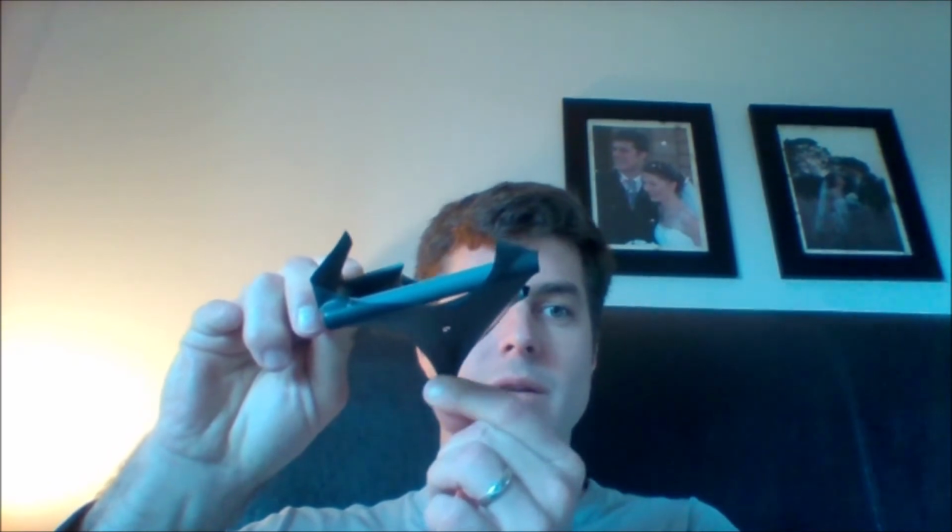It's not going to go in and work perfectly the first time, like with your first couple of rubber dams. I'm sure might have been a mess. Mine certainly was. And the key to it would be to learn to adjust so that the position, again, lower lip at the edge of the chalice. Contributing to its efficiency is if you have a nice little bowl-shaped, almost like a weir, and the draft of air over the mouth would then also create a little vortex so that the aerosol can drift up and go to where the air pressure is lower into the suction.